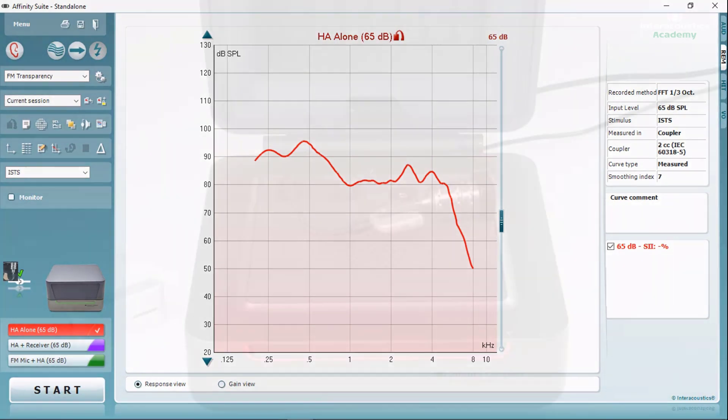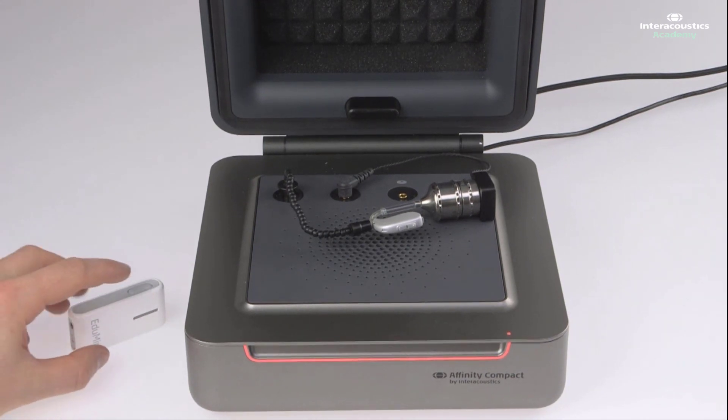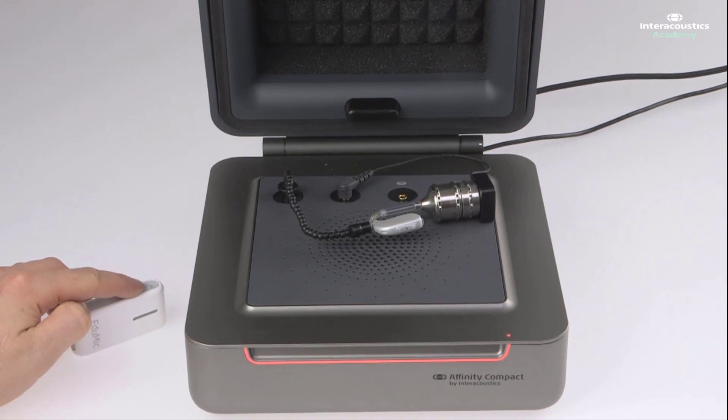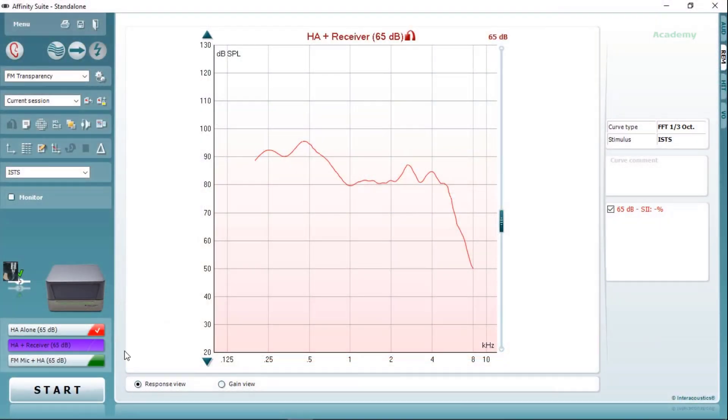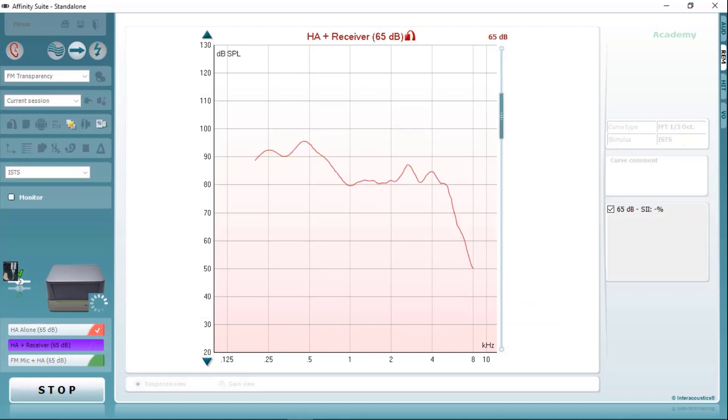Once the test is finished, we are now ready to complete the second step, which is to switch the FM system on. Here, we still keep the hearing aid inside the test box, but we activate the FM system to see if there is any artifact or noise coming into the system. We come to the second stage of the protocol and run the response. Here we should expect to see an identical frequency response as we saw on the previous curve. After 12 seconds of ISTS signal, the frequency response begins to match exactly what we were expecting to see.